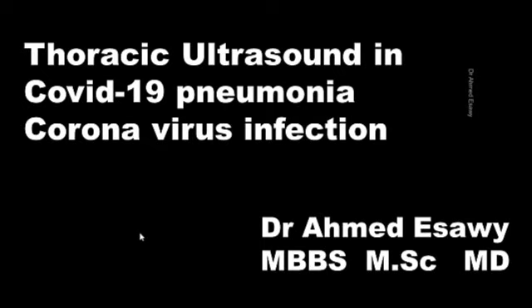Thoracic ultrasound in COVID-19 pneumonia, coronavirus infection. We talk in these lectures about the role of ultrasound in COVID-19 pneumonia. The benefit of ultrasound over CT is that it is cheap and easily accessible. It is easy to find ultrasound in many regions and centers, but CT is not available.